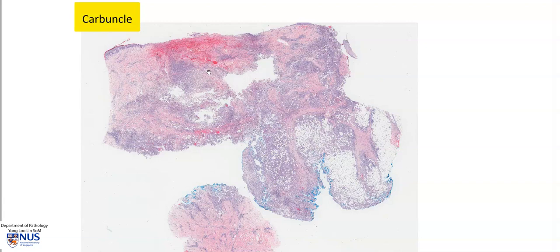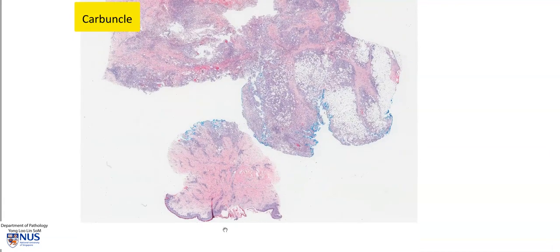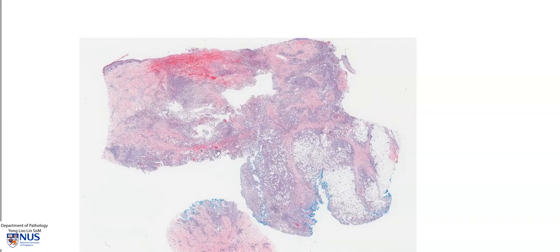So here is the carbuncle, and we are going to focus on this larger tissue piece. There is also a smaller tissue piece here, which is facing the opposite direction with the epidermis located here, and the dermis. In this larger tissue piece, we can just about make out the epidermis on the surface. Here is the dermis, and here is the subcutis.